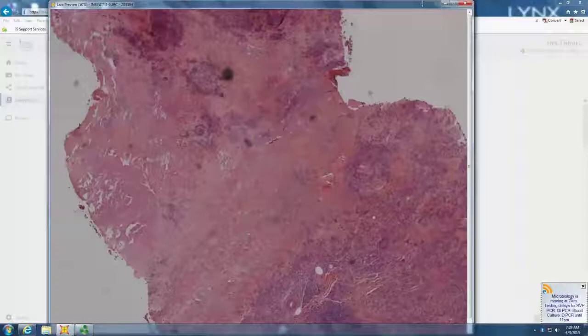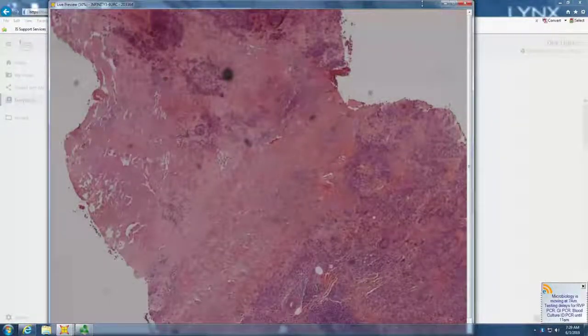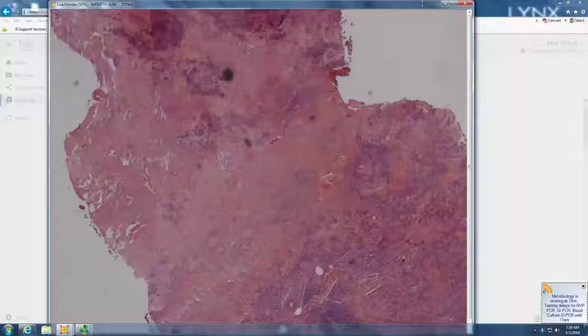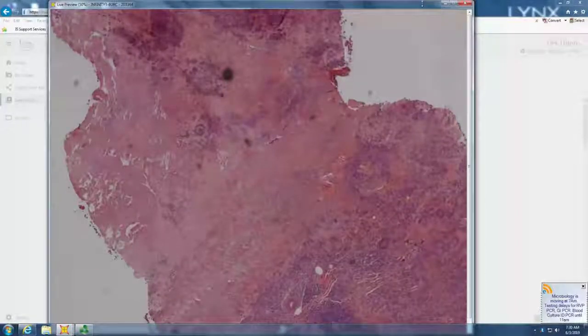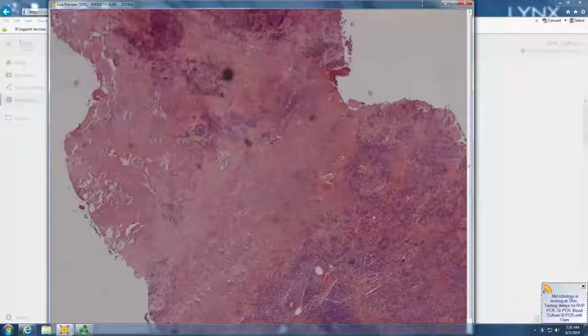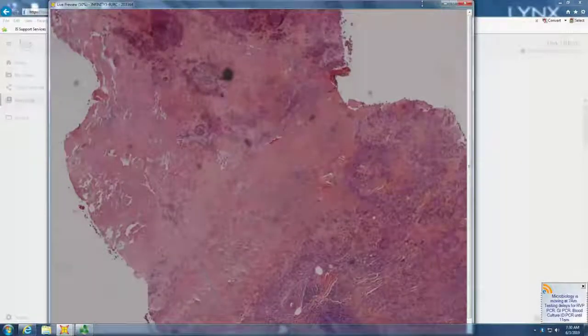So we don't have a big enough piece, because this is a narrow punch, not an excision. We can't see the X-shaped zones of necrosis. But you see there's necrosis, or so-called necrobiosis of collagen, but then there are wreath cells like a xanthogranuloma, which is how it gets its name, necrobiotic xanthogranuloma, NXG.